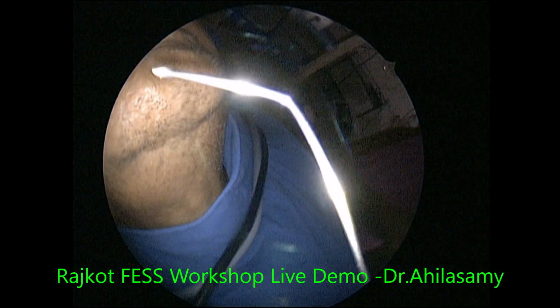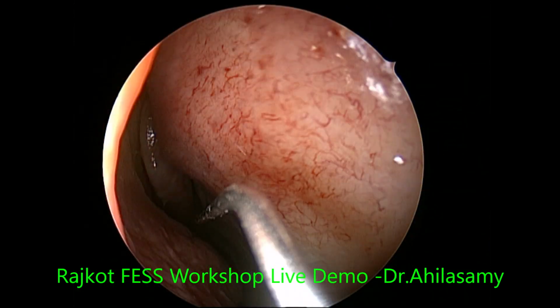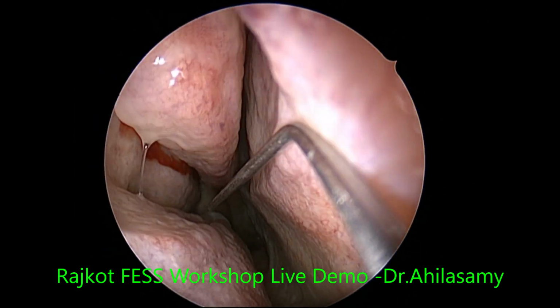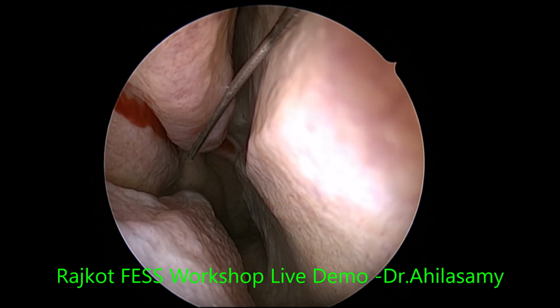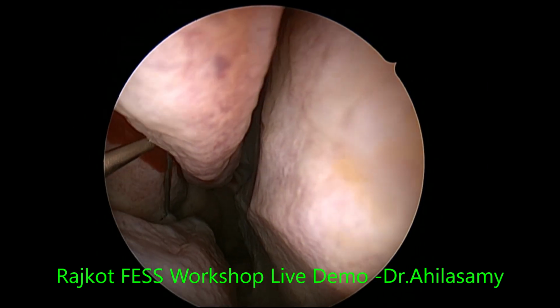So now I have taken a 23 gauge spinal needle and the tip I have bent to an angle, and now I am giving the sphenopalatine block. There is a small camera tilt there. Please excuse me. You should not have a camera tilt at any time of the surgery.